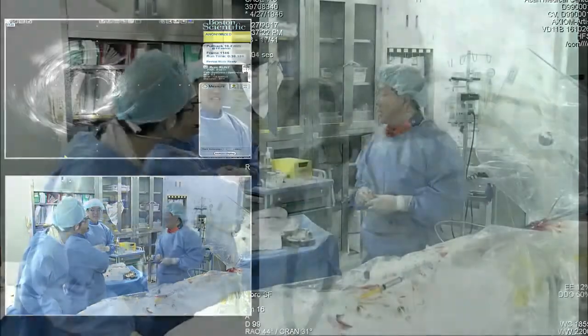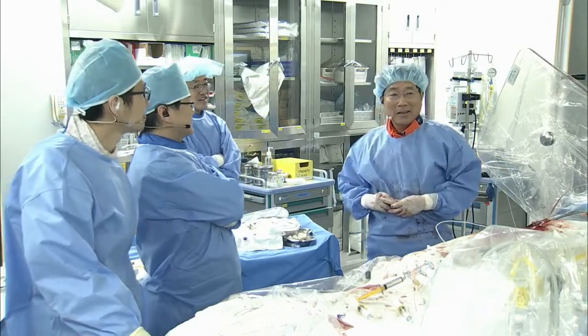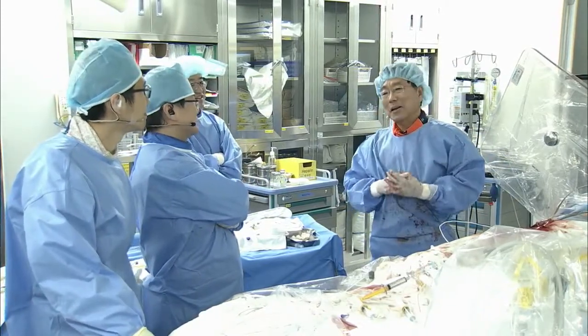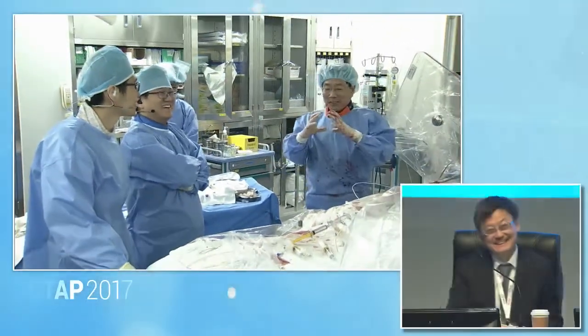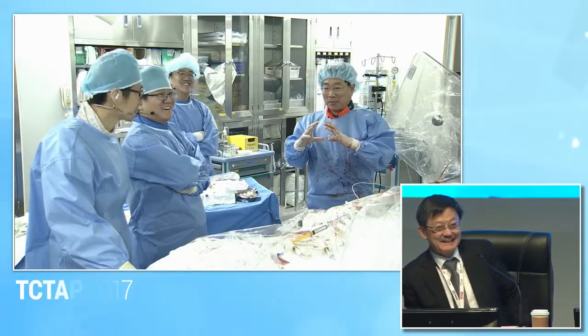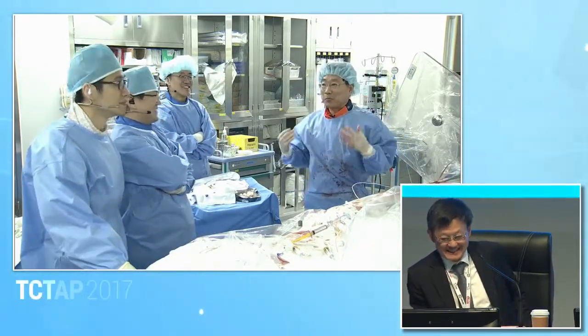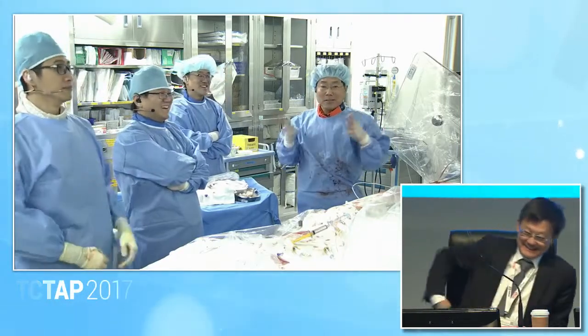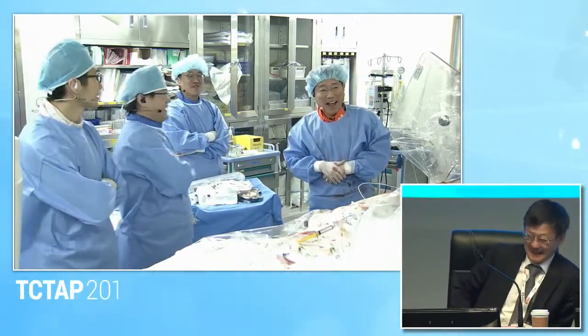You can choose any type of stent. In side branch passing, are some stents difficult, some stents easier? No, I don't believe. Look at this. It's a marketing point. Yeah, it's a different company. All right, side branches, lumen wise, is ours bigger than the others? However, totally, we are very fair. I don't believe. We are very fair.